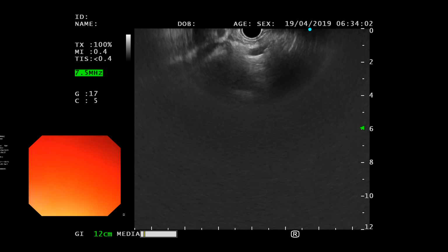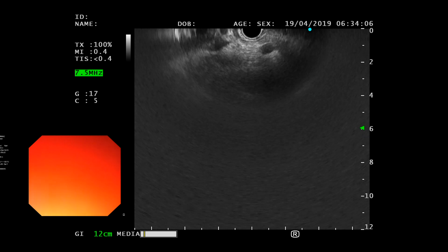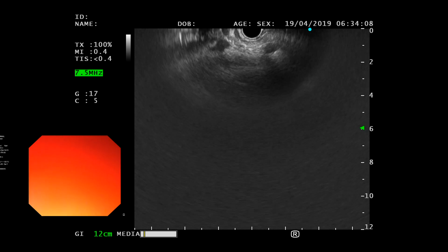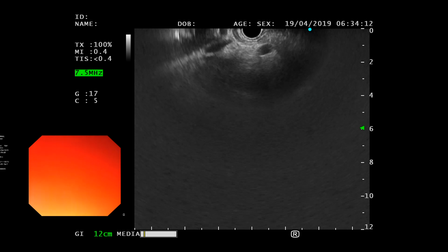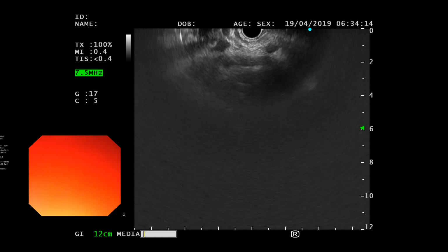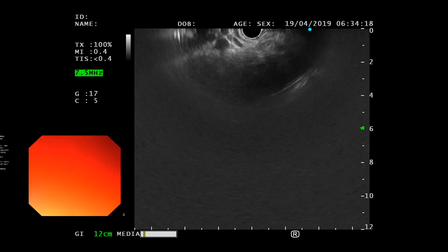Now, in lymphoma there's not going to be a peripancreatic fluid collection, but in acute pancreatitis there is going to be a peripancreatic fluid collection, and the fluid is going to appear just like ascites, anechoic fluid. Okay, now what else can be there in the pancreas?